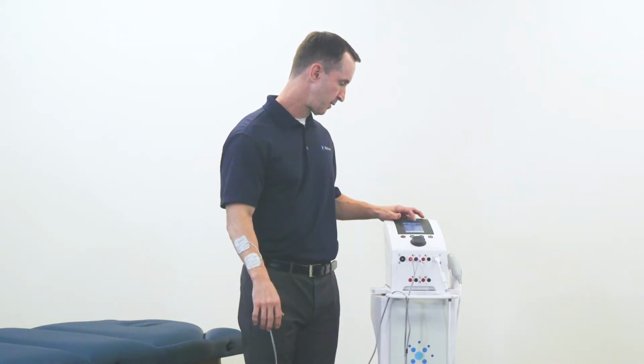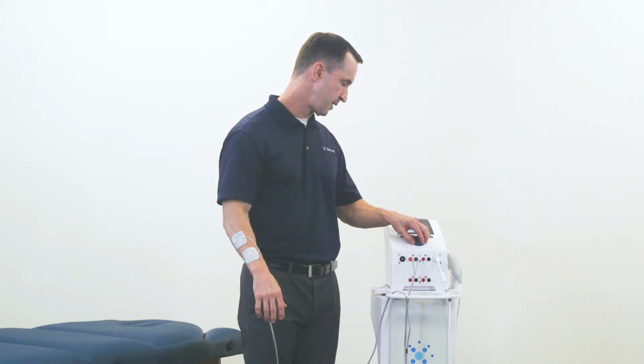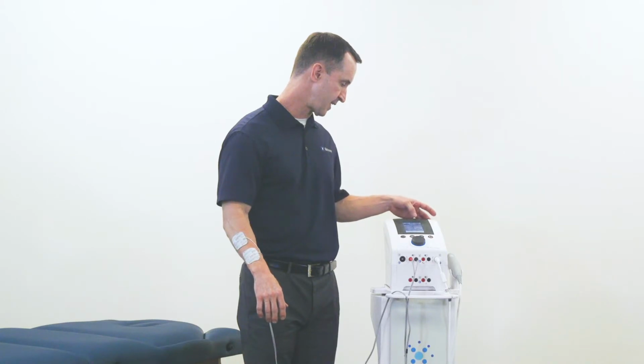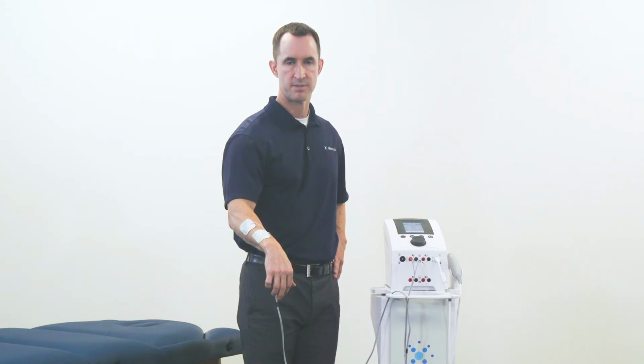In a second here, we'll show you a 5-second ramp time. I'm going to hit the pause button, select the ramp option, increase the dial to 5 seconds, and hit start once again. We'll go into a full contraction, hold for 5 seconds, and then take 5 seconds to go down to 0 milliamps and rest for 5 seconds, and then repeat the cycle.